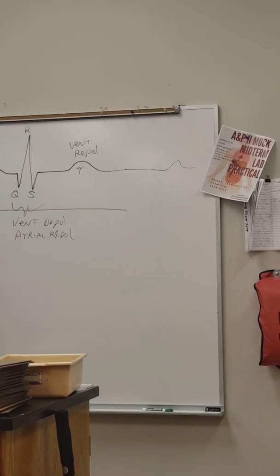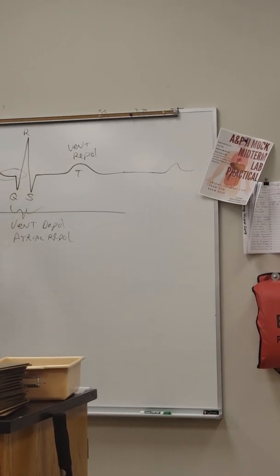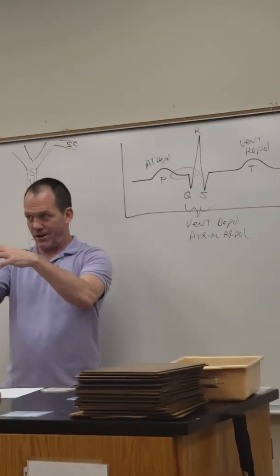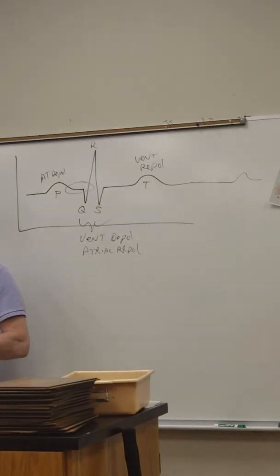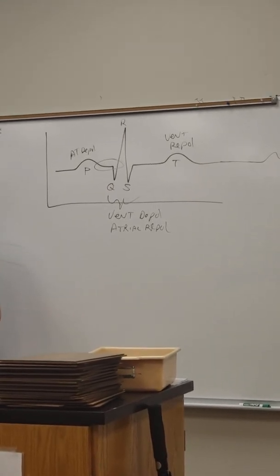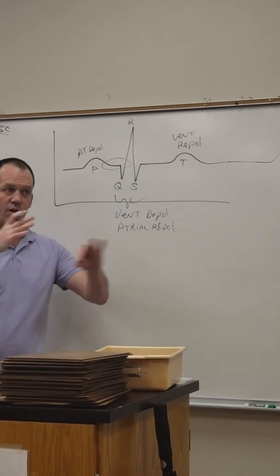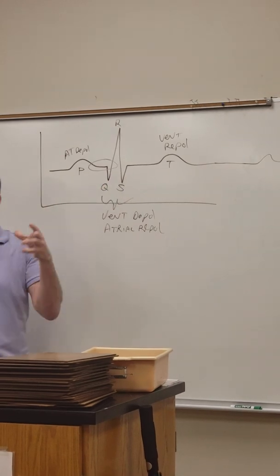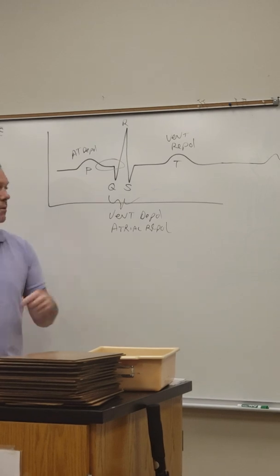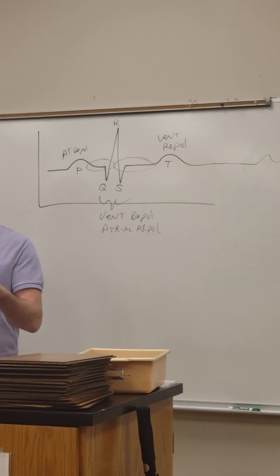So this atrial depolarization causes, sometime later, not represented by anything on this graph, the atria to contract. So the P wave, that atrial depolarization, causes atrial contraction. Got me? It's a cause and effect. The electrical thing causes the mechanical thing. This big signal is because you've got big muscles in your ventricles. This is ventricular depolarization, when all that sodium rushes into the heart muscle. Afterwards, somewhere in here, it's going to cause ventricular contraction.